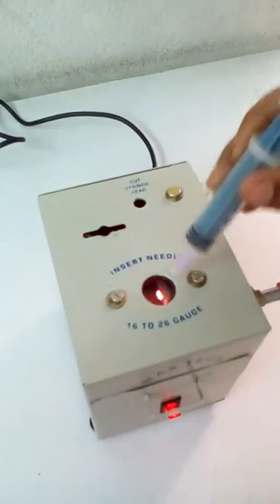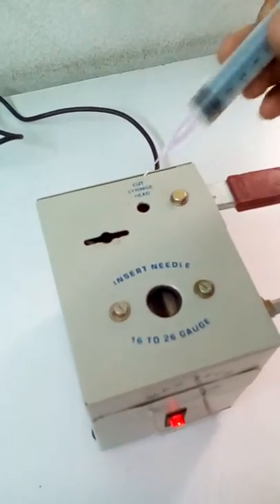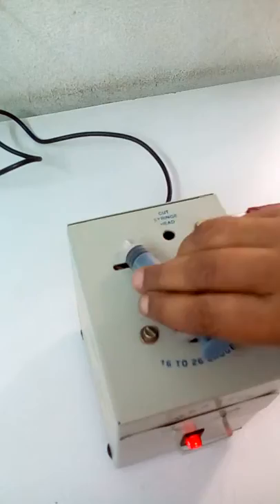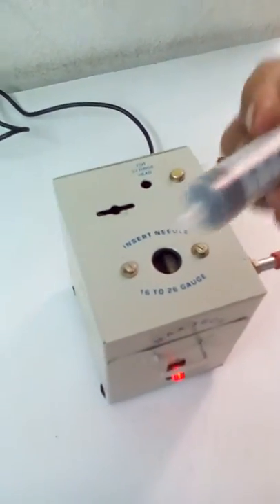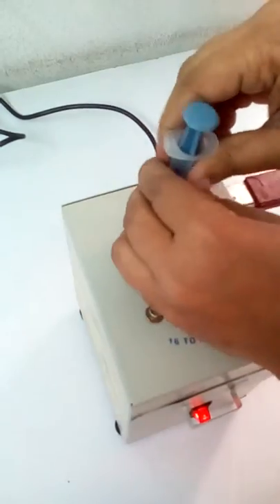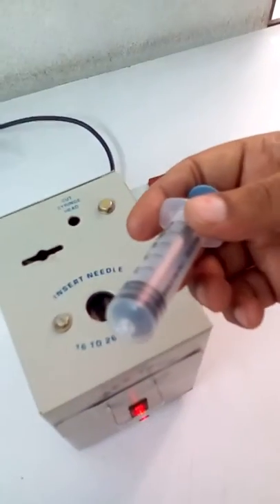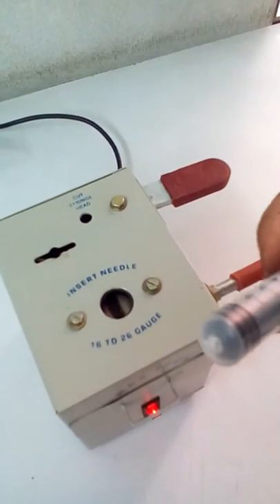The needle is placed in the electrodes and it burns. Now the needle has been removed and the syringe head will be cut. You can see the syringe head has been cut and the needle is already burnt.